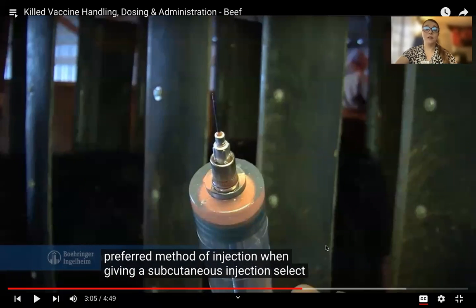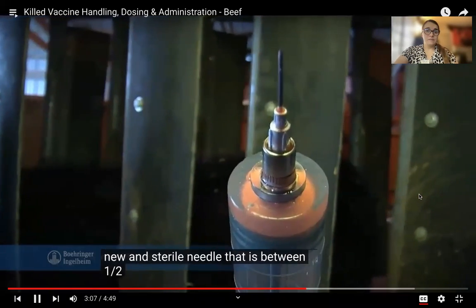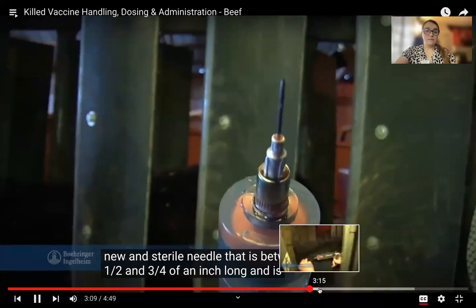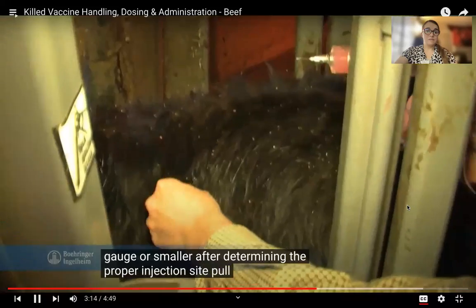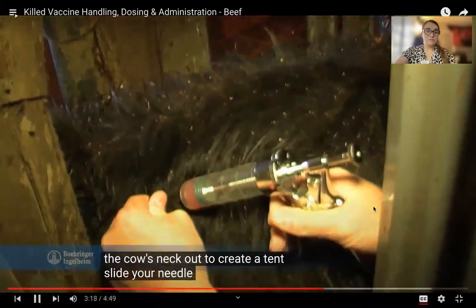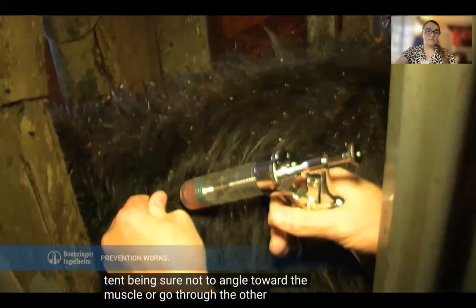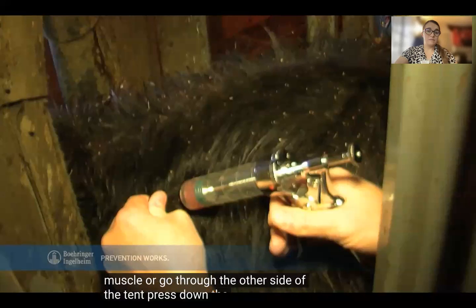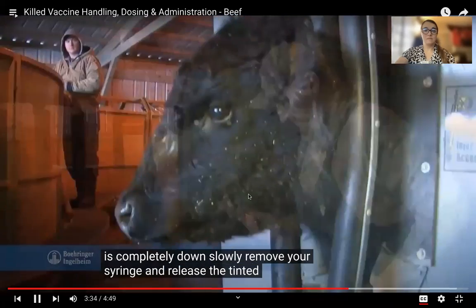And again, with horses, a lot of the time it's IM. Select a new and sterile needle that is between 1/2 and 3/4 of an inch long and is 16 gauge or smaller. After determining the proper injection site, pull the skin on the cow's neck out to create a tent. Slide your needle in at the base of the tent, being sure not to angle toward the muscle or go through the other side of the tent. Press down the plunger on the syringe, going slowly to avoid an influx of air under the skin. Once the plunger is completely down, slowly remove your syringe and release the tented skin.